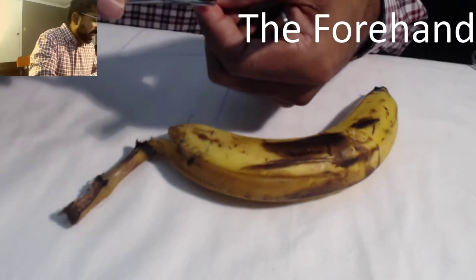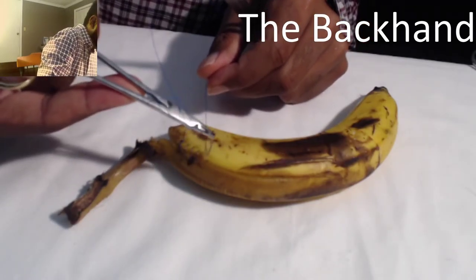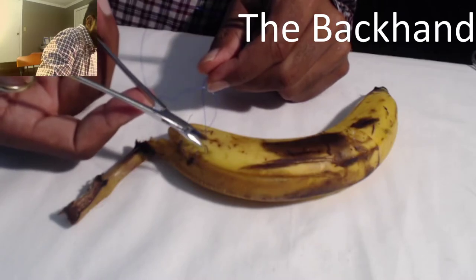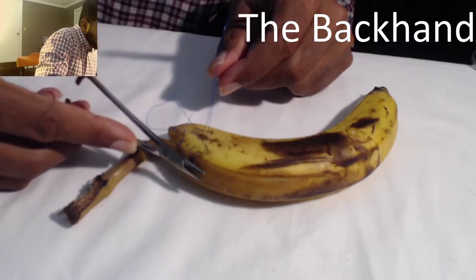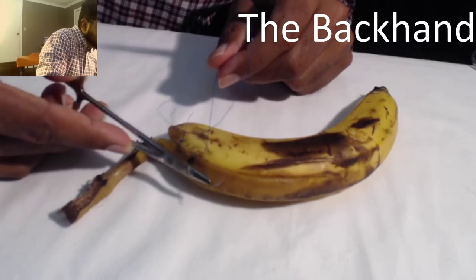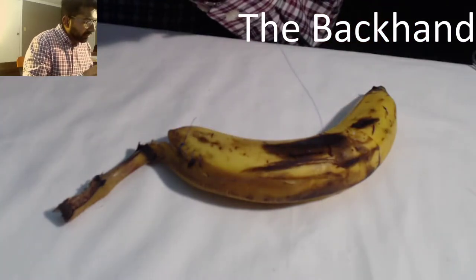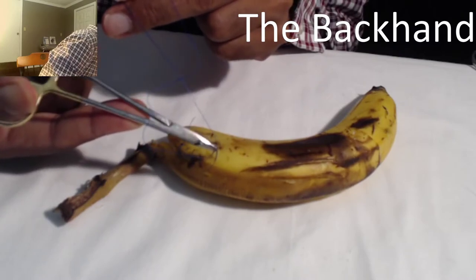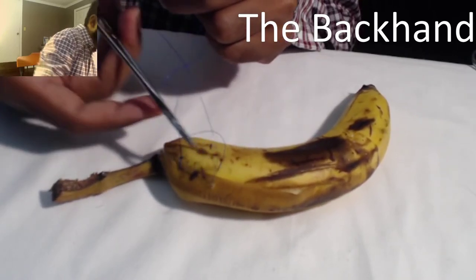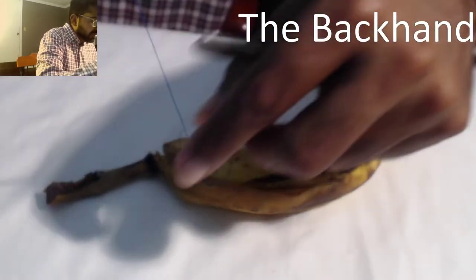Let's take one more forehand bite, then switch it up to the backhand. Backhand is very similar — the needle is loaded slightly away from me. If you're keeping your fingers in, that's fine. Remember, you've got to hyper-supinate, take the bite. I'm not torquing it, otherwise it will tear through. I'm going to pronate this — nice. I love the backhand; it's a nice, gentle motion. It always forces you to use the curve with the needle, and here we are, back to where it needs to be.